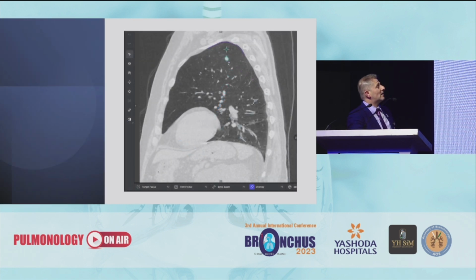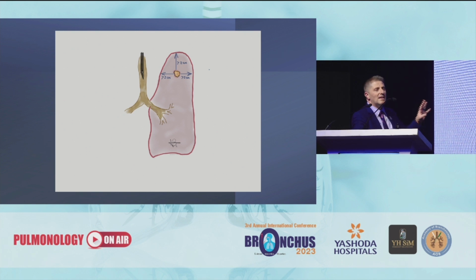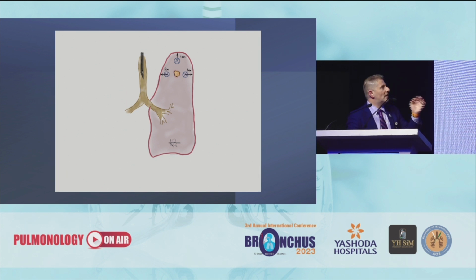So even in the sagittal, you have at least 5 centimeters that way, 2 centimeters that way, and 3 centimeters apical. So whenever we face something like that, and we see more than 2 centimeters, we had the chance now to learn the best way to do the evaluation. When we see anything with such a case, we try to create what we call a phantom or ghost signal, which is, by the robot, we create another target that is beyond where the real nodule is to help placing the fiducial in that area closer to the pleura to help having the signal light up in that area.